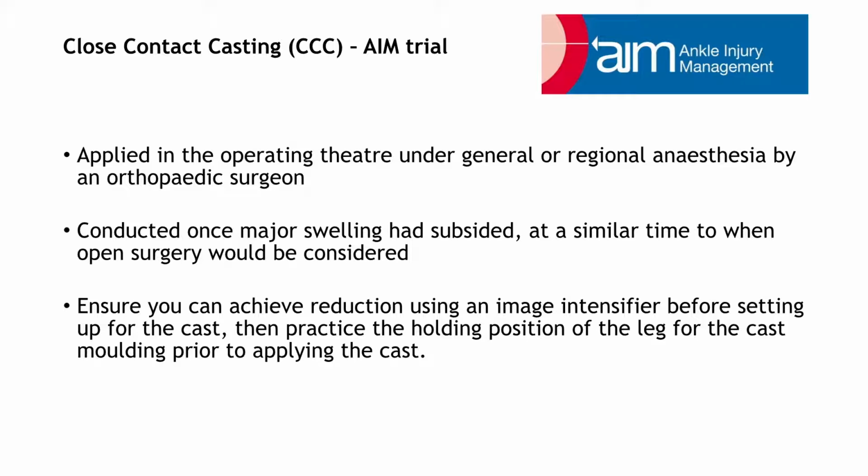Close contact casts are applied in the operating theatre under general or regional anaesthesia by an orthopaedic surgeon. The rationale for anaesthesia is to enable a sufficient application of pressure to reduce the fracture if it is displaced, and also to mould the cast effectively.